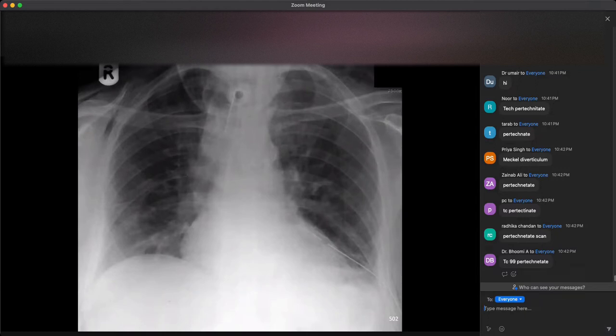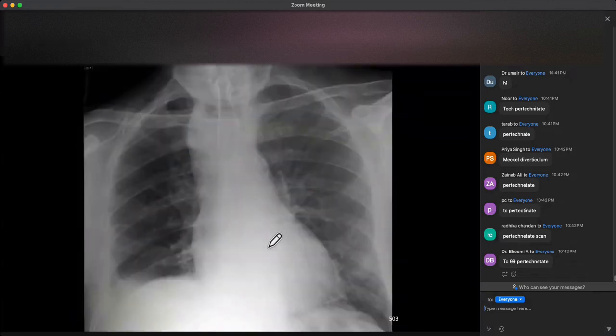Emergency tracheostomy for a patient who had head and neck cancer. So they did an emergency tracheostomy, which resulted in surgical emphysema. There's the tracheostomy here, surgical emphysema here, intercostal drain went in. And about 4 days later, the patient became very febrile, and that fever was a bit concerning. So they did another chest x-ray. And what can you see on that chest x-ray?